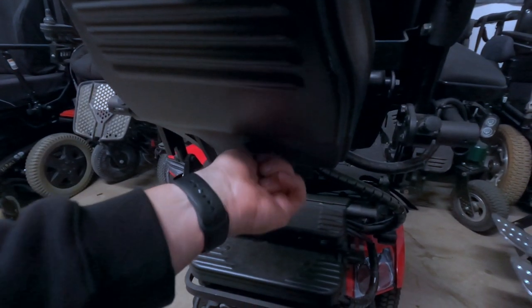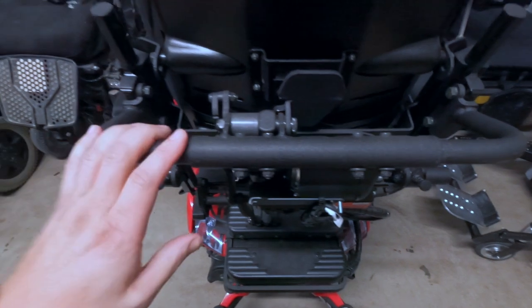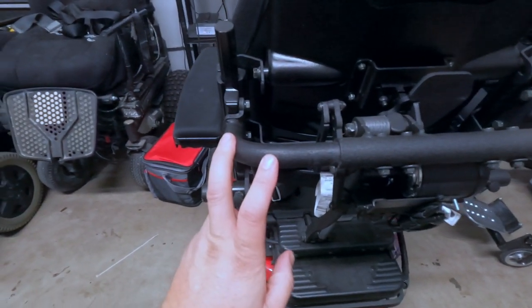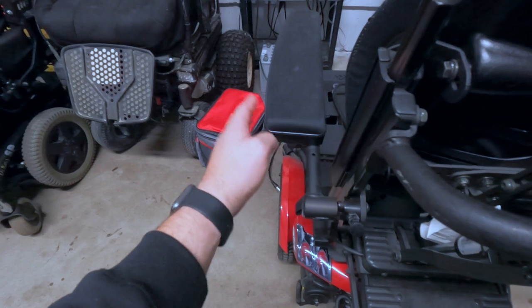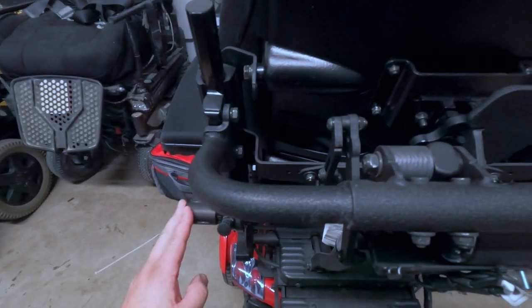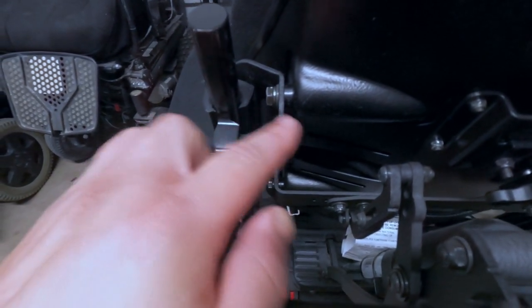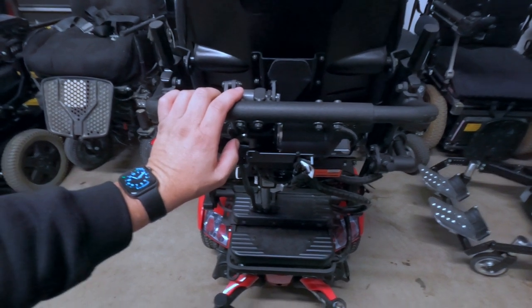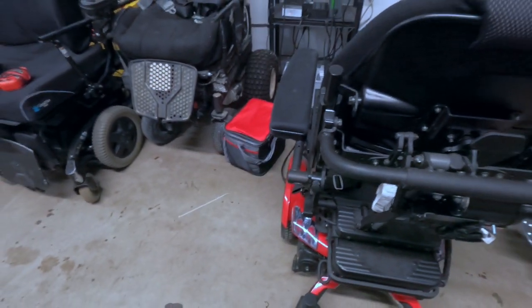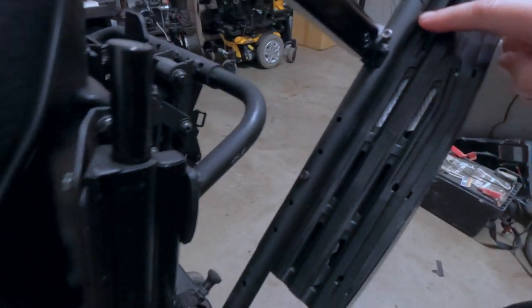Now that I'm looking at it, I can see there's some adjustment down here, and under this cover — that just came right off — there's a thumb screw. We do have the width adjustment bar here. After looking at this though, if I make the whole thing wider it's going to push these armrests out further, and this is about as wide as I want. The problem was putting another backrest on with this style of mounts — it was a little more than an inch wider for the mounting and there wasn't enough clearance. But these armrests appear to be adjustable — we've got three different positions here.